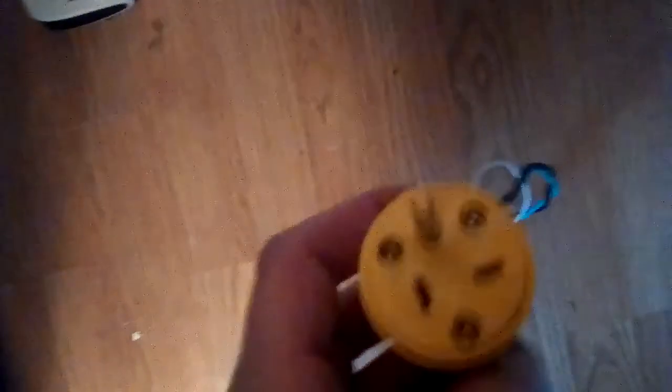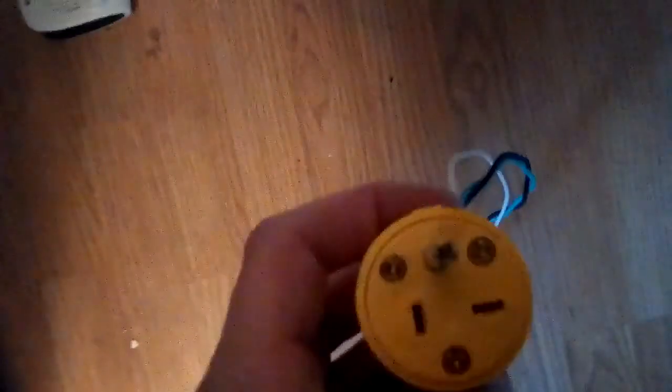Here's the extension cord. Here's the plug-in. What I did was I just took an extension cord, I cut the plug-in off, I replaced it with a different plug-in, and I took every prong out of it except the ground prong, and I tied all three of these wires to that ground prong. So I always plug this into there. When I'm ready to go in there, I got the oxygen machine on. I just plug this on, wait for it to inflate.